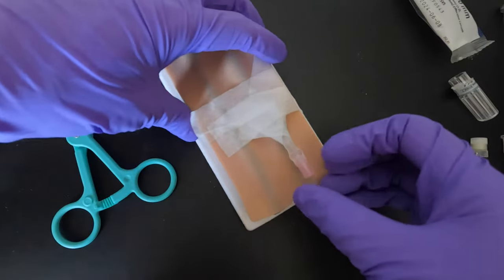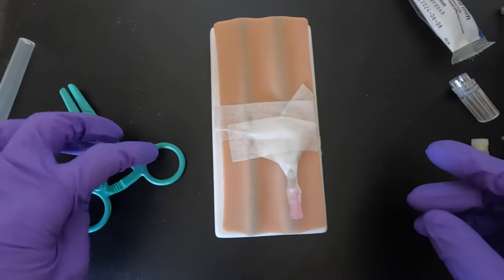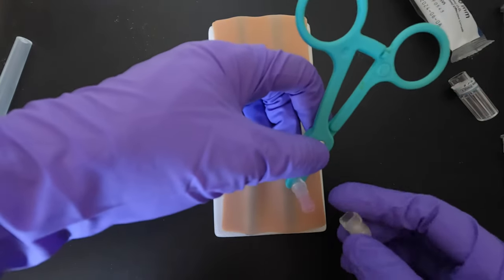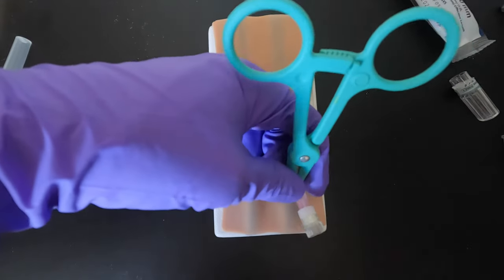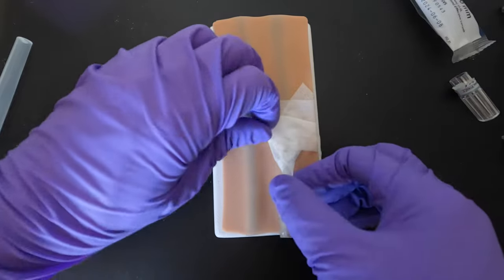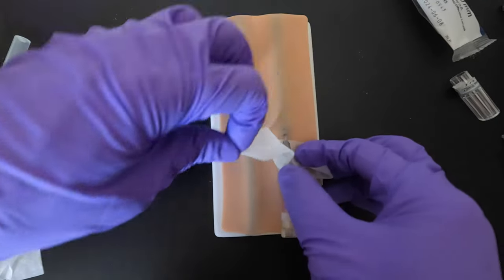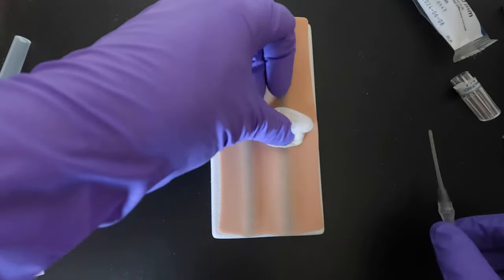After re-infusion — assuming you've connected your blood lines and need to re-infuse the patient — stop the machine, clamp this one, then take the blood lines off. You can cover it with any cover you want. Take the clamp off from the blood lines, then take off the clamp, and that's when you disconnect and take off the needle from the patient. Same as usual: take the tape off gently and apply pressure where the needle is.